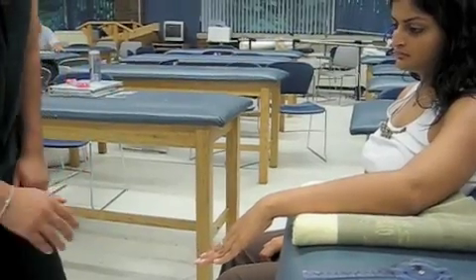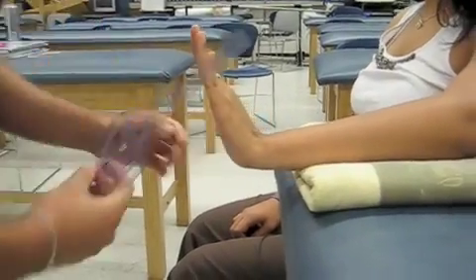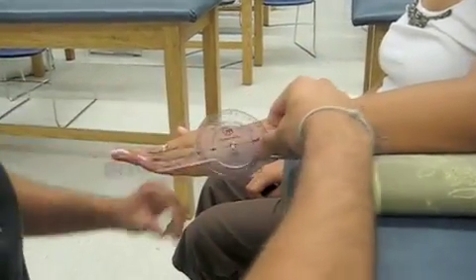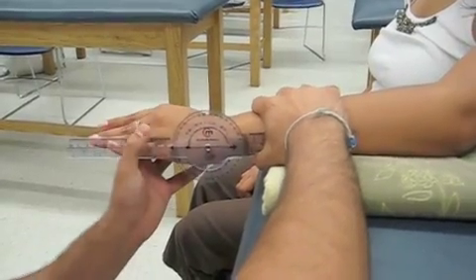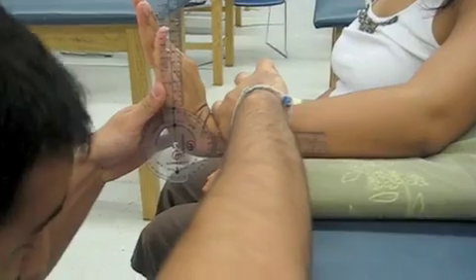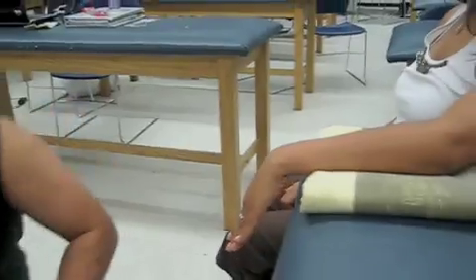First we're going to do extension. I'm going to have Deepo extend her wrist, then bring it back down. Now I'm going to do it and put a little overpressure to get the end feel. The axis of rotation goes distal to the styloid process of the ulna. The stationary arm goes to the lateral epicondyle, and the moving arm goes along the base of the fifth metacarpal. I'm going to extend her wrist and apply some overpressure. She has 92 degrees of wrist extension, and the normal for that is 70 degrees.